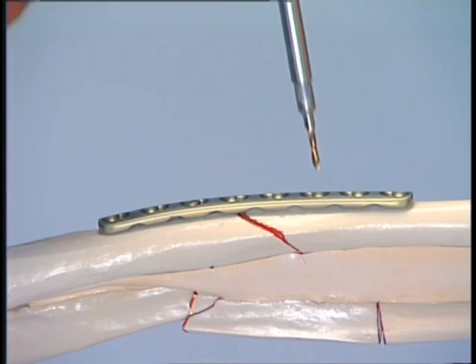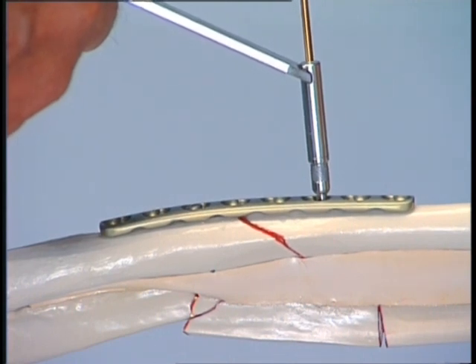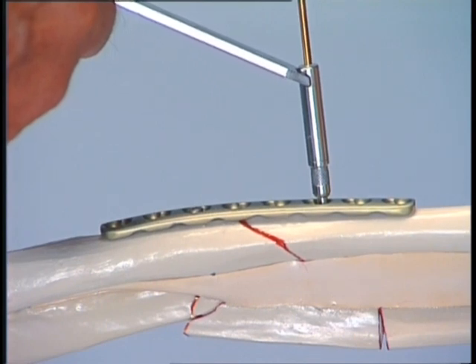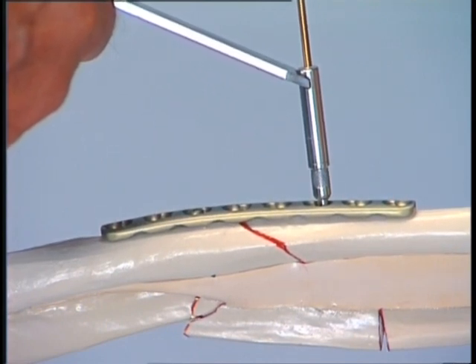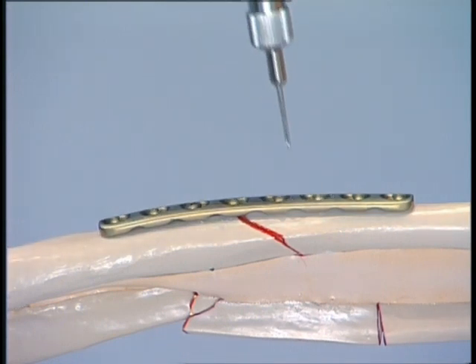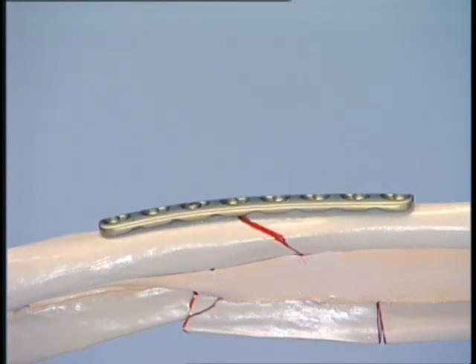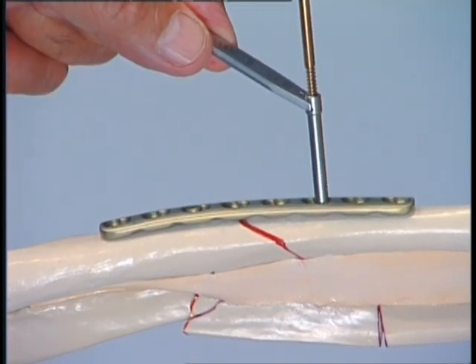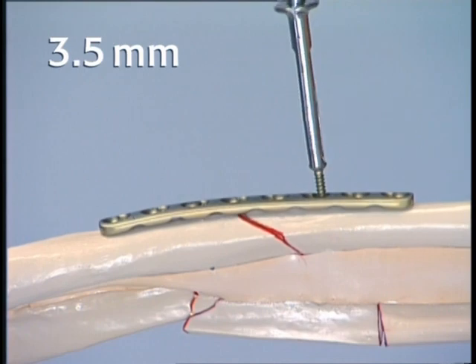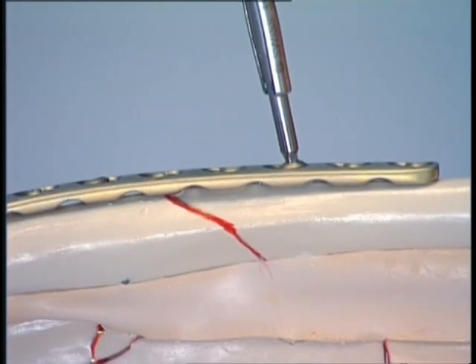In the distal fragment, a second hole is drilled close to the fracture using the universal drill guide in the compression mode to place the screw eccentrically into the plate hole. The telescopic sleeve of the guide may not be pressed onto the bone; instead, the sleeve is only held against the smooth end of the DC plate hole. The depth is measured and the thread is cut. The appropriate length 3.5 mm screw is inserted, and by driving the screw home, axial compression is created.